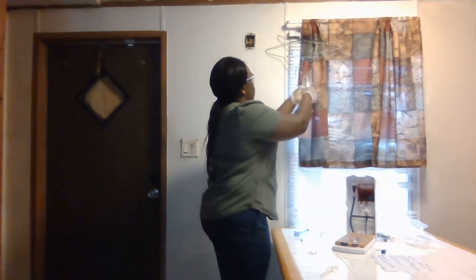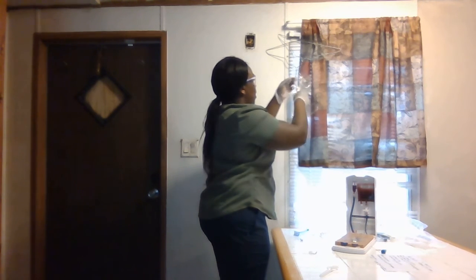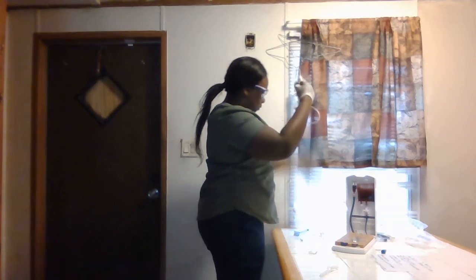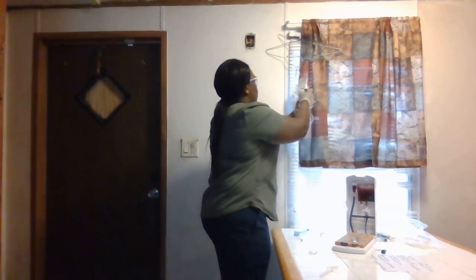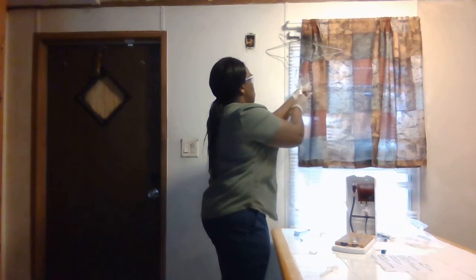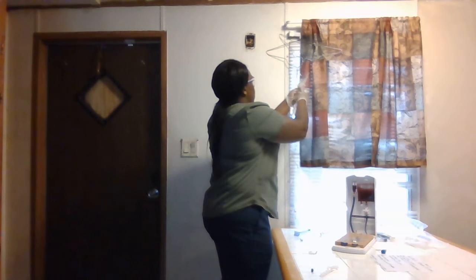Again, I kind of have to hold it here because I don't want to pull my hangers down. I'm going to take this off, but I know that I can't contaminate this because this is considered sterile. Pop that. Twist, turn, twist, push, and again put some of our fluid in the drip chamber.